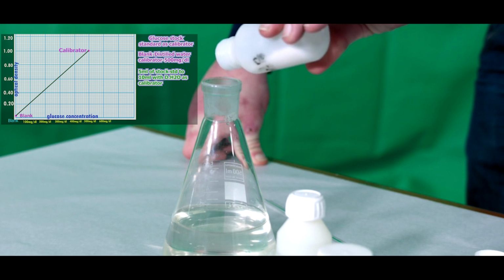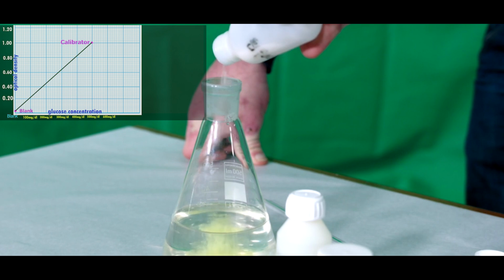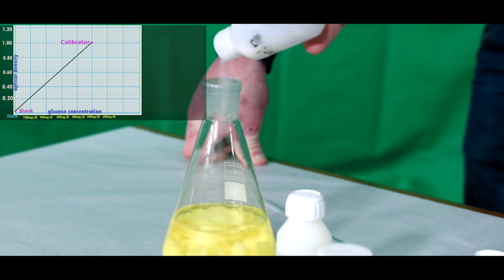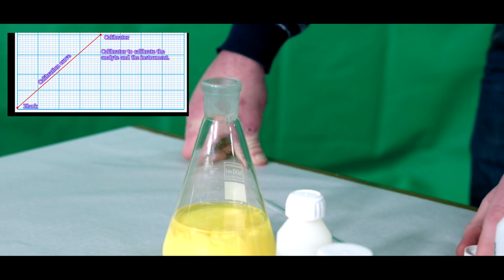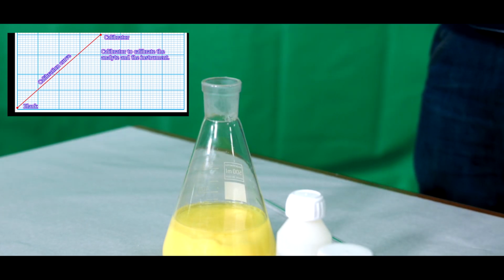In today's video, we will see the commonly used biochemical reagents, the standard calibrators, and the quality control materials. Standard solutions contain a single analyte with known concentration. Standard reagents are used for comparison and to determine the unknown concentration present in the patient sample.